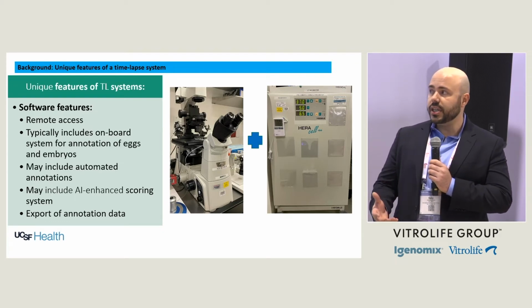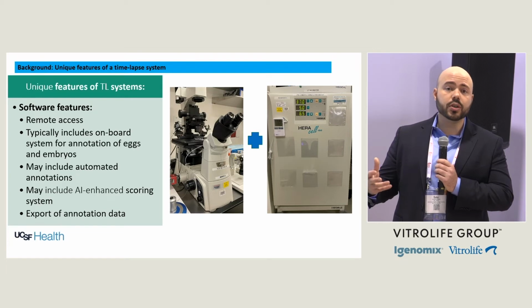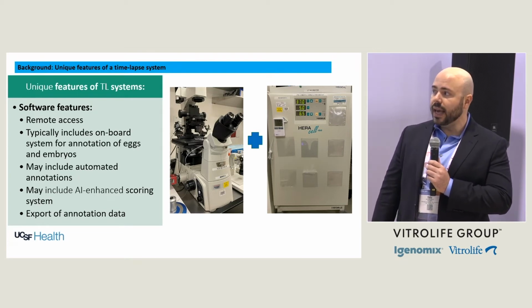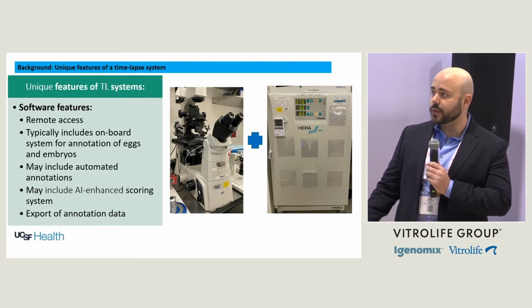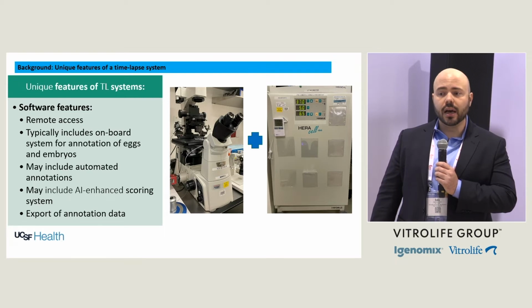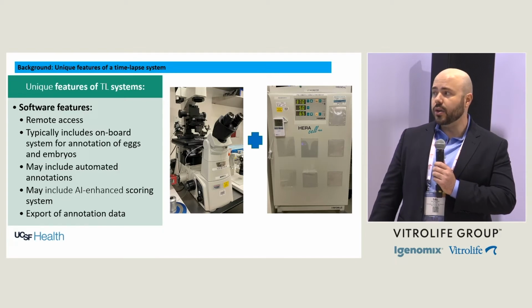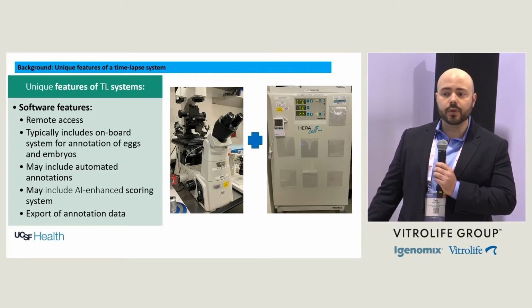You may have some annotation possibilities, where the KIDScore system, specifically with the EmbryoScope, provides you guided annotation, which can help train future embryologists. And the scoring system is really a great feature that is to the point. You can do your ABC grading system with your trophectoderm and ICM, which is pretty precise from my experience. And best for those data researchers and folks who would like to continue doing retrospective data work or research with the data provided from the EmbryoScope, you can export that data into a CSV and create more future research.